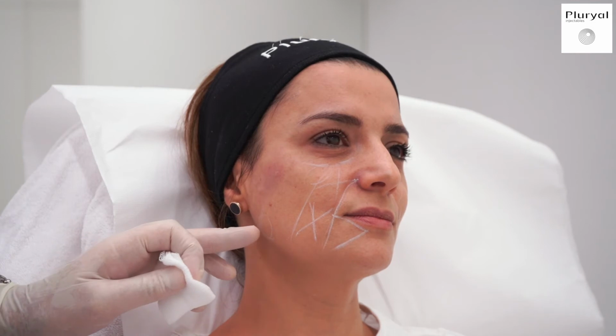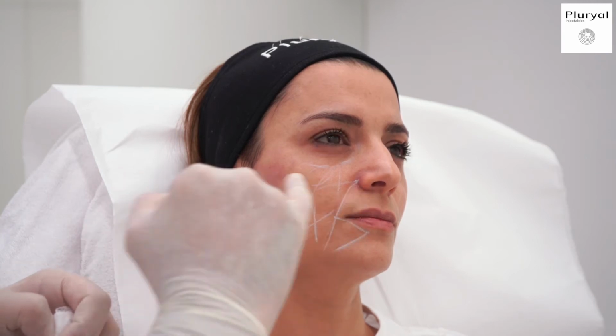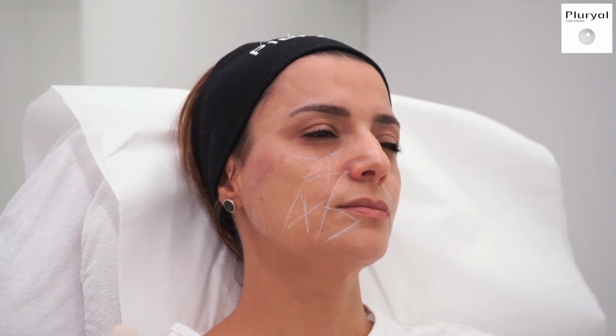Now we will move to the gonial angle and also to the base of the nasolabial fold. I will do boluses in both sides just to lift them up. Usually I don't treat a lot the piriform aperture, but with some patients, when we get older, the piriform aperture gets wider. So we need to just give it a little bit of lift to push the upper lip forward.